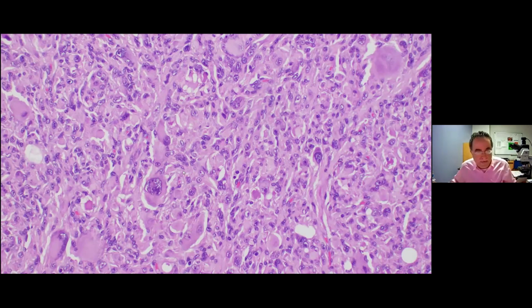Okay, so this is a pleomorphic xanthoastrocytoma, and I'm going to show you why it's called that. I'm sure you guys know that xantho means lipid. Pleomorphic means the tumor cells have significant atypia and pleomorphism, with some bizarre cells like this one and that one. And here you can see a cell where the cytoplasm is finely vacuolated because of the accumulation of fat. So in this single field, you have pleomorphic cells and some xanthomatous cells.